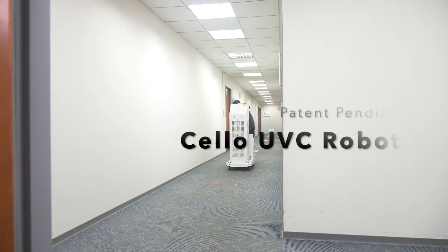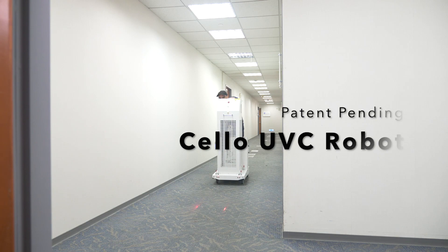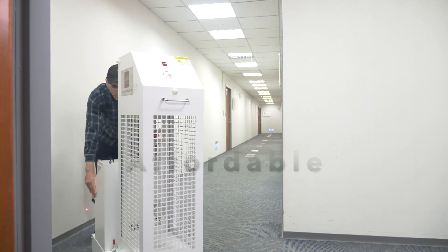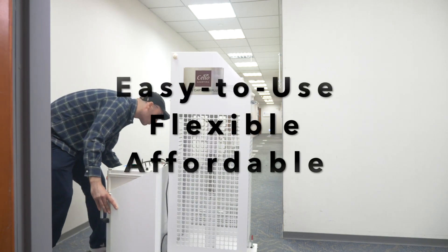To resolve these issues, Cello Lighting invented the Cello UVC robot to provide three key benefits: affordable, flexible, and easy to use.